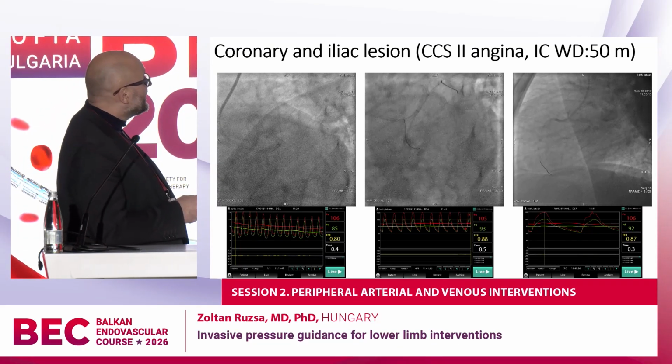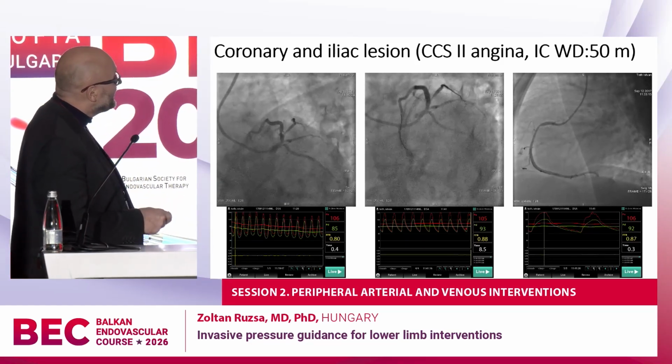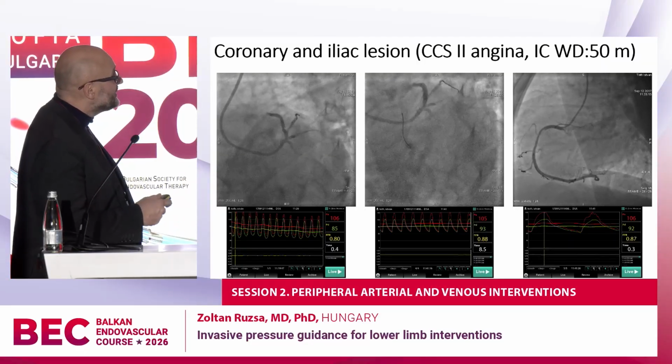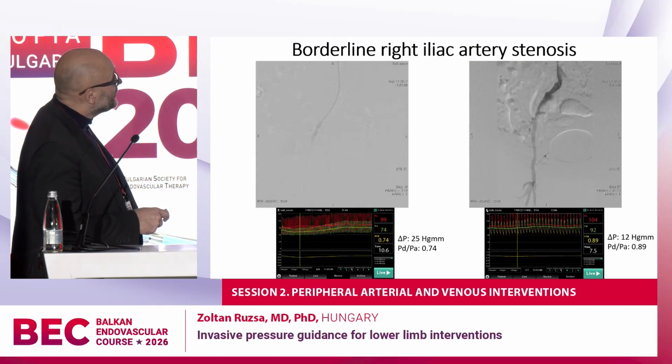So this is one case of mine. It's an LAD lesion with the right. I measured, of course, the LAD, the diagonal, and the right, and no one was treated because there was no significant difference. And the patient also has claudication.